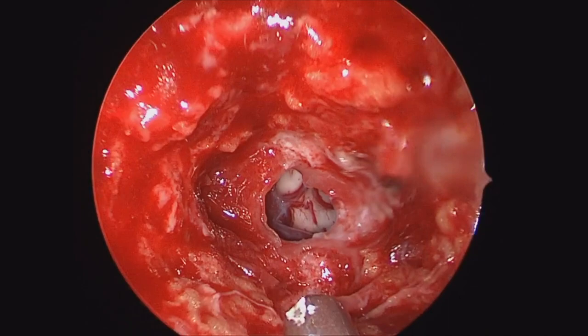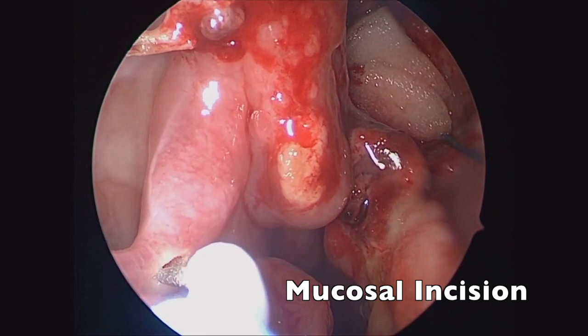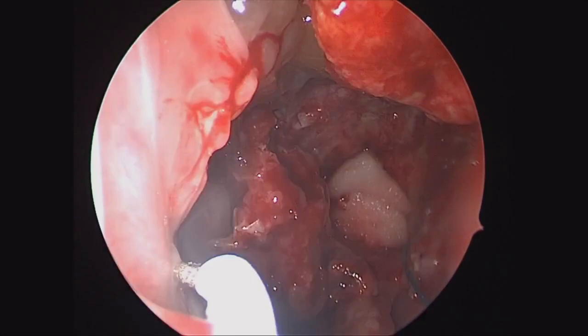As you can see here, this is her dural defect following the resection of the transdural tumor. There's a very large septal defect, so we're Dopplering out the arterial supply of the inferior turbinate, and then making our initial superior mucosal incision with a needle-tip bovie cautery.